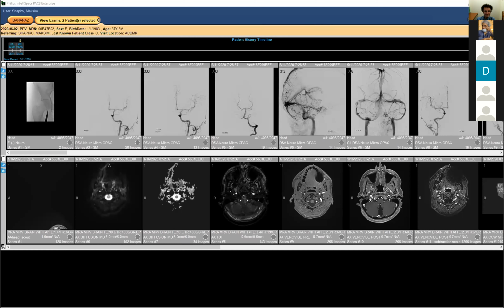So to me, it doesn't make any difference. It's just a vein which enters the dura before entering the sinus, which is always like this. Every vein of the brain will enter the dura before entering the sinus. When it's in the tentorium, it's tentorial. But if it's on the superior sagittal sinus, it's up there. So I don't see a big difference.